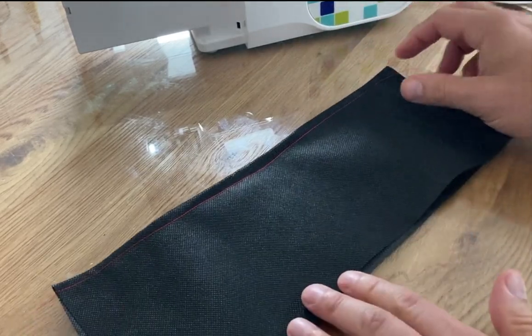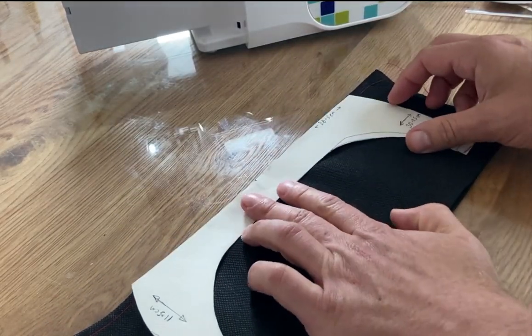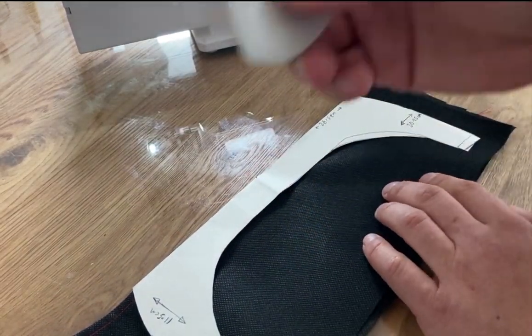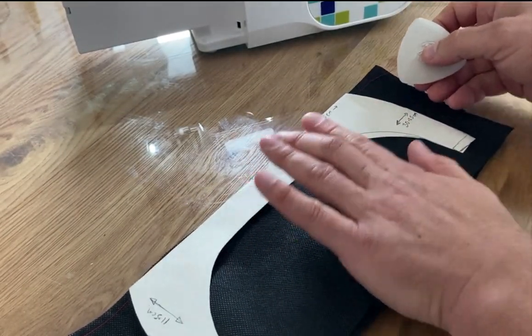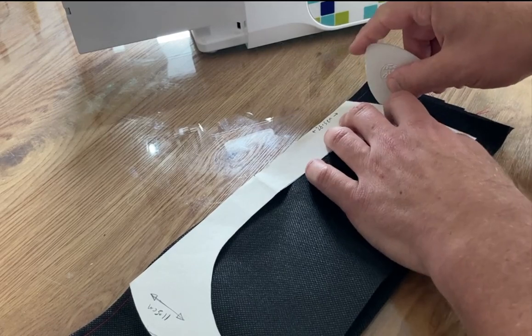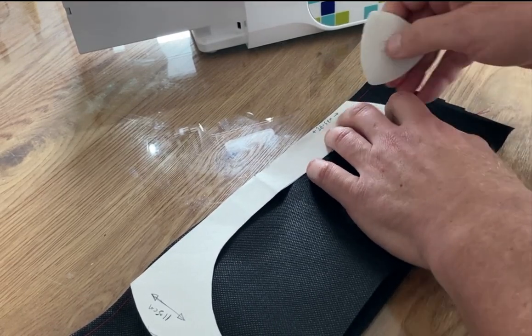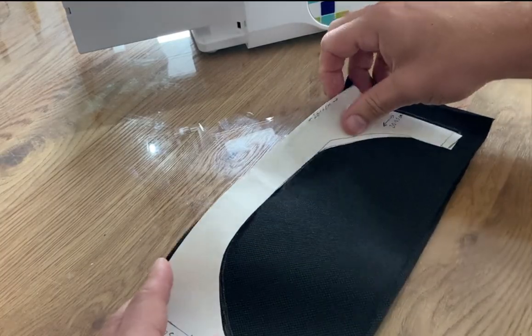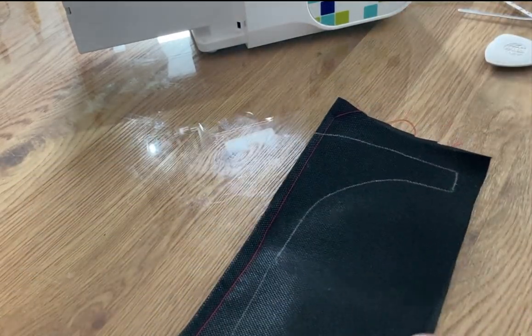afterwards. So next thing for me to do is to put the template on, and using chalk, I've previously used a white Sharpie, but I've just run out. I'm gonna pencil on the outer range of this. Right, so now we have the drawn on template.